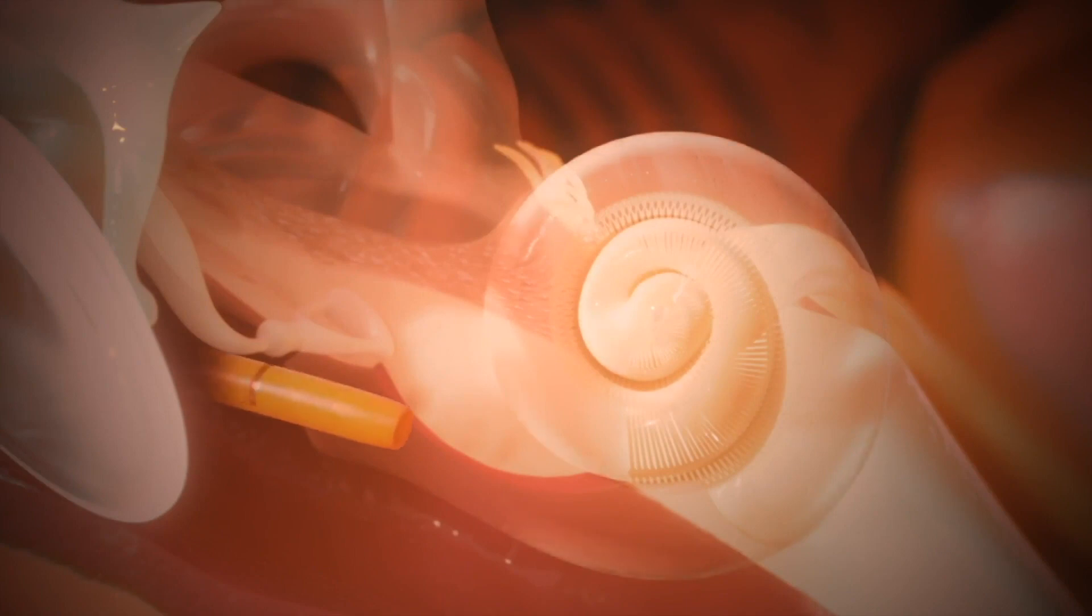A cochlear implant has an electrode that bypasses damaged or missing sensory hair cells, delivering electrical signals to the hearing nerve and mimicking the function of a healthy inner ear.